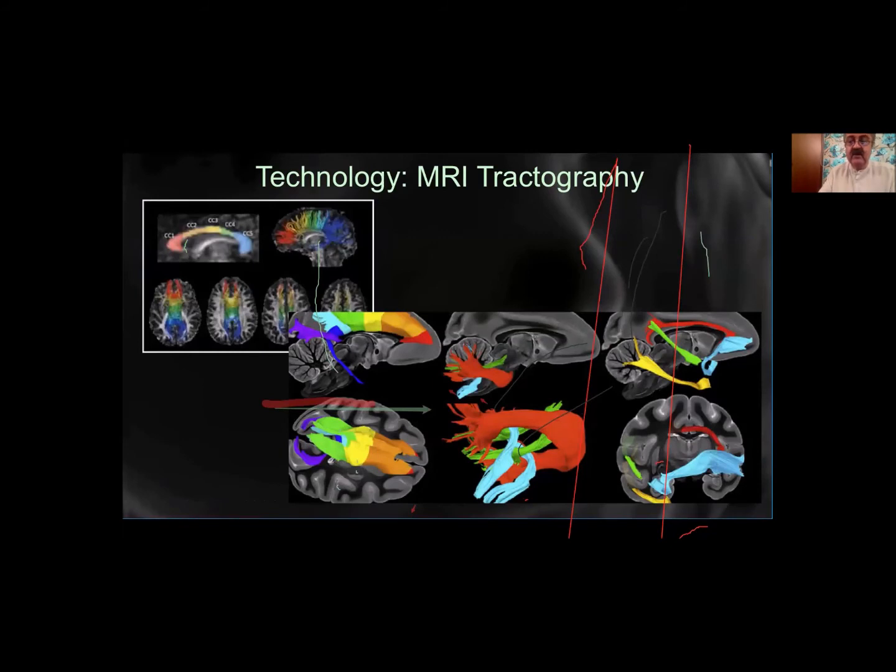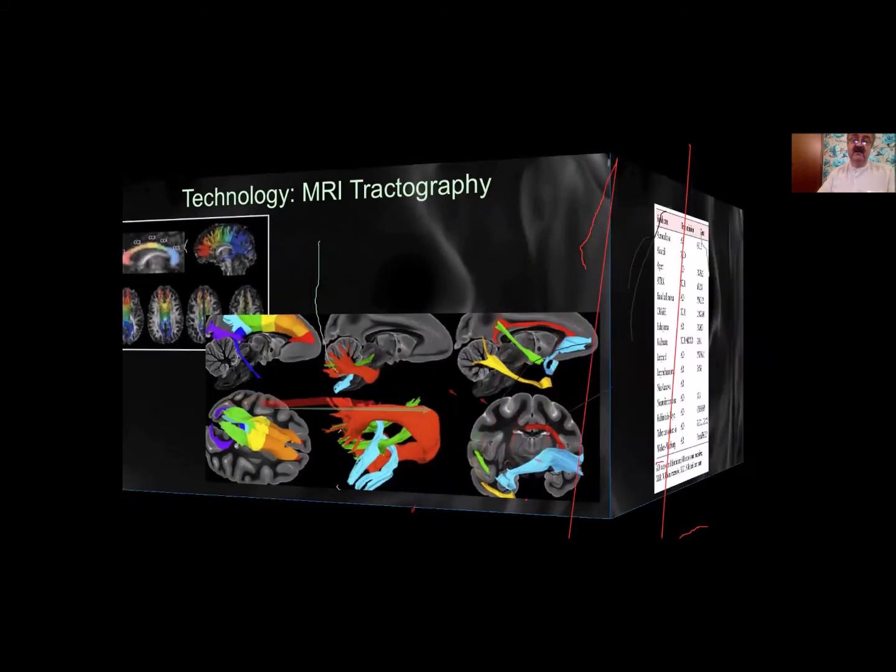And when you ask for MRI, it's not any old MRI. It cannot be a 0.5 Tesla MRI. Most of these studies would require a 1.5 or a 3 Tesla in a specific situation. Like in corpus callosum, you need tractography, which means that if the corpus callosum, which connects the left to the right, has parts missing, are these fibers going to the back and coming back? If there is a communication, then the prognosis is good. Or are they not? Is there complete interruption? That's called tractography. And therefore, you will make your referral to a place where MRI tractography is available and is being done by a person who's familiar with how to handle things like this.